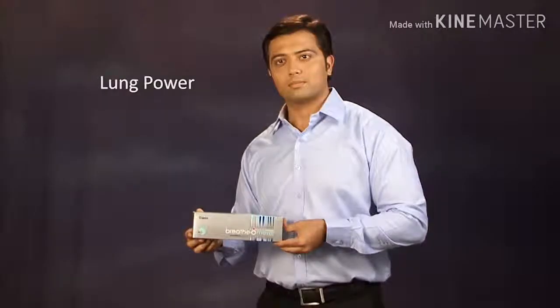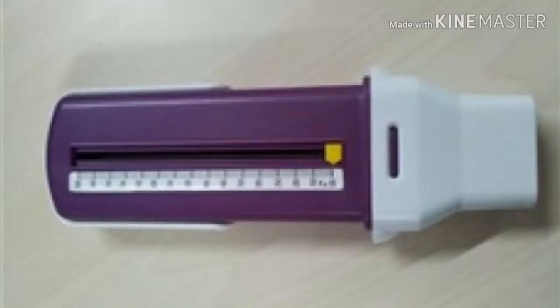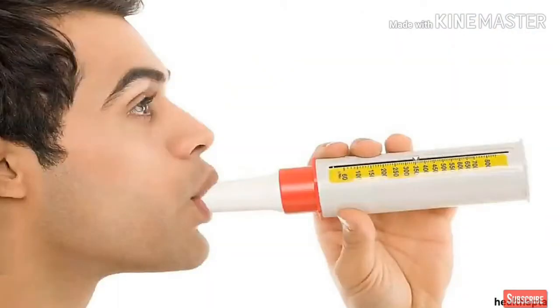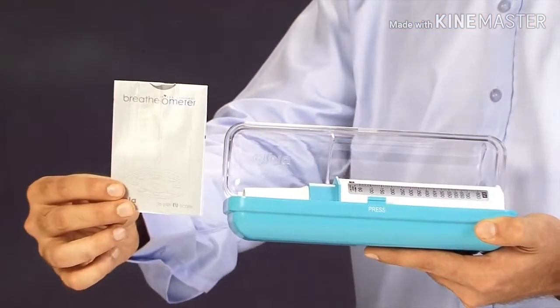I will show you how easy it is to measure your lung power — that is PEFR, peak expiratory flow rate — using this simple device called a breathometer. This is a breathometer pack. It contains a breathometer and a patient information leaflet. You can always refer to the patient information leaflet to know about your breathometer in detail.